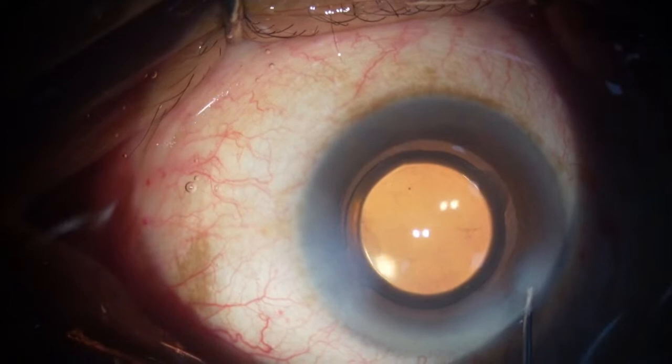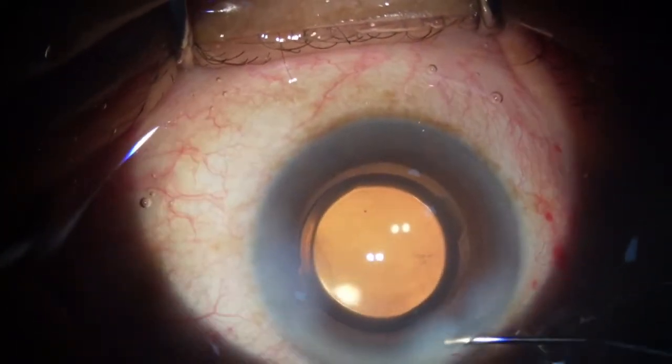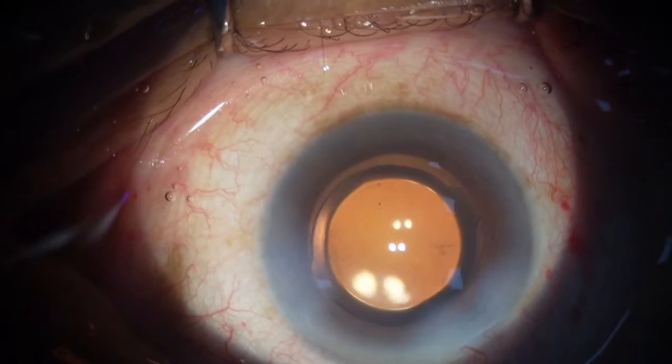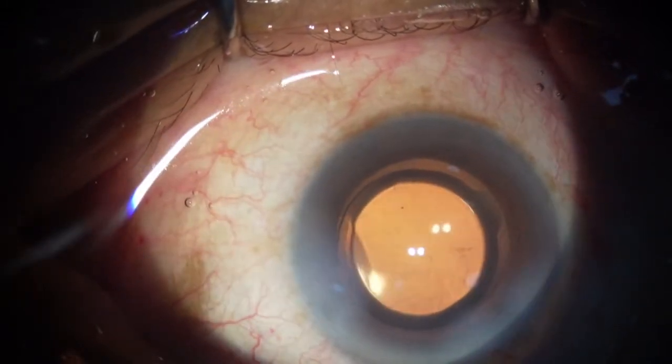Just the sealing of the incision. That's my routine. And the AC is well formed. Just pushing in a little moxifloxacin.